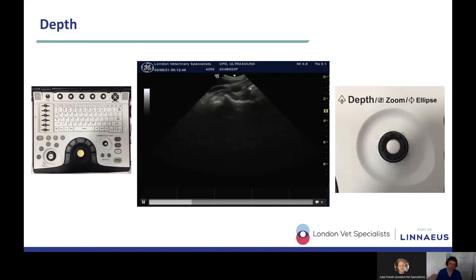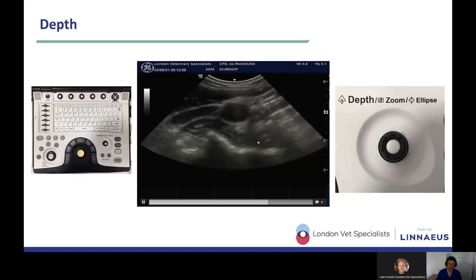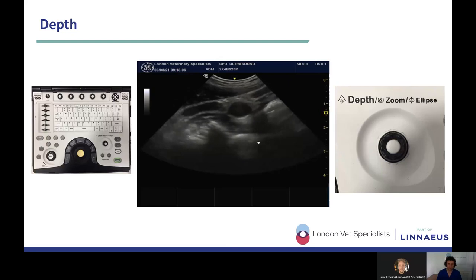So why have we got such a high depth set up on our screen? The structure we're interested in is way off there in the distance. We're going to need to change our depth so that the structure that we're interested in is more in the near field, so we can see what's going on. So the depth is something that you're going to fiddle about with quite often during your ultrasound exam, because sometimes you're going to be looking at superficial structures, sometimes deeper structures. So the depth gauge is one that you're going to get very familiar with.